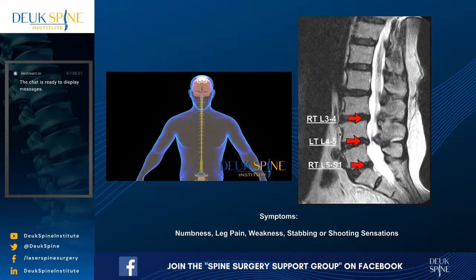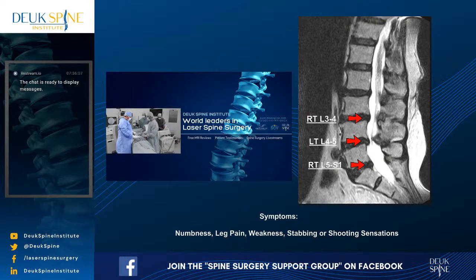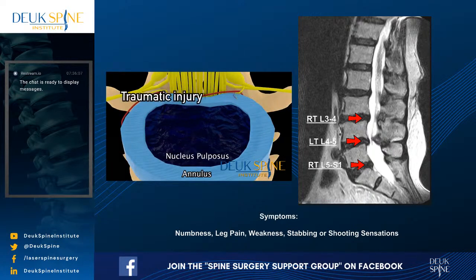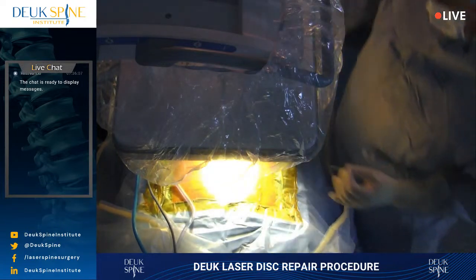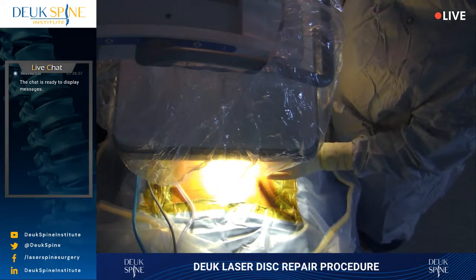You're all right. That's just numbing medicine. I apologize. Okay, so first thing we're doing is we're just numbing up the skin so that we can make it more comfortable for our patient. Just lay still. You got to lay still, all right? It's very important. So on the left side, it's L4-5. Everybody in agreement?